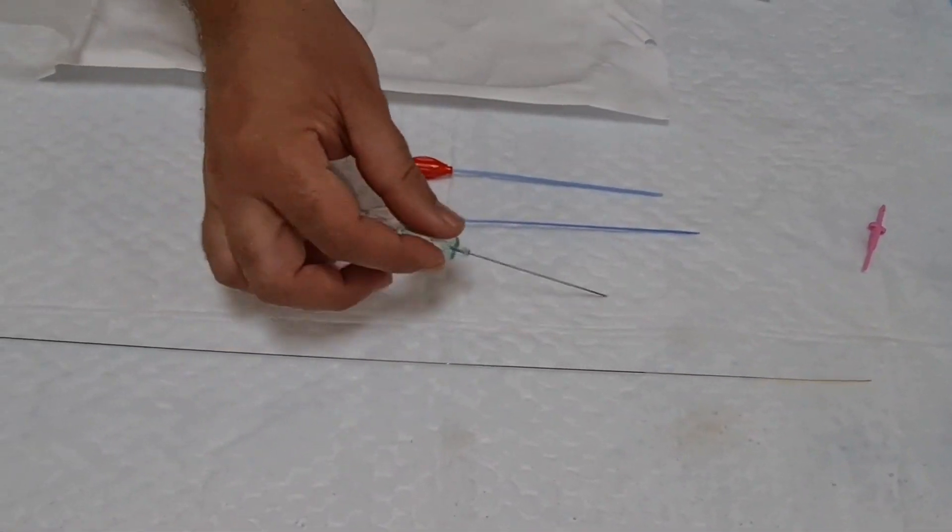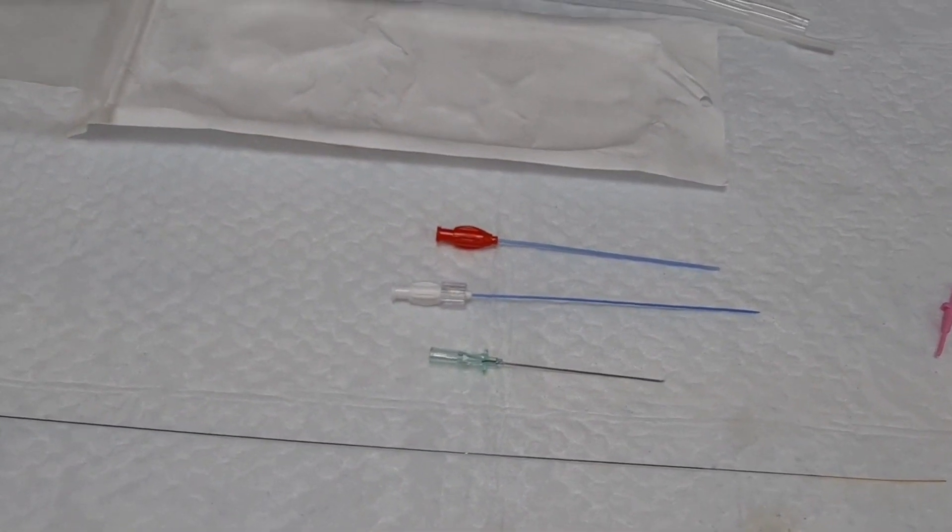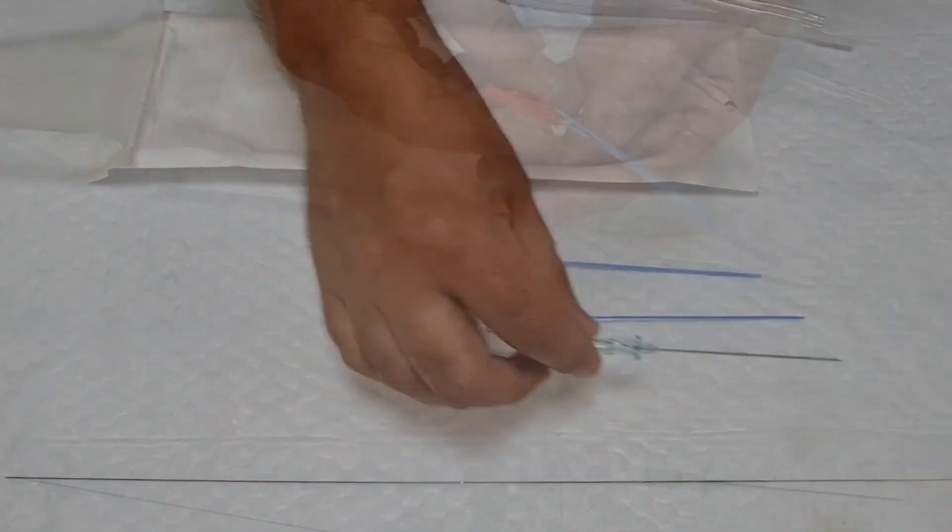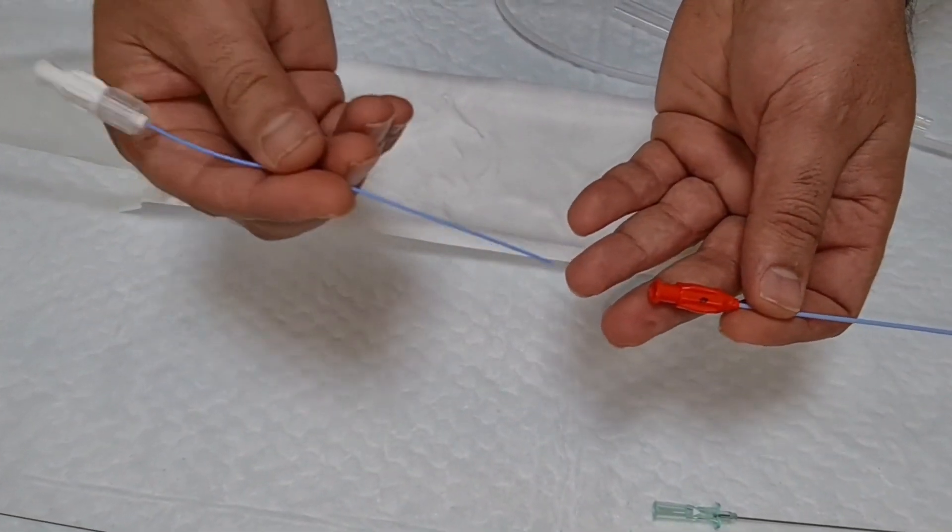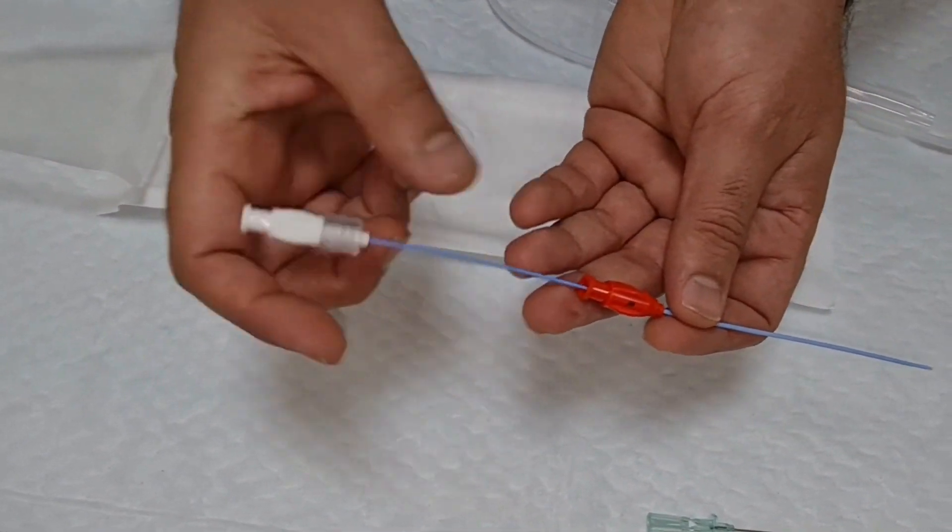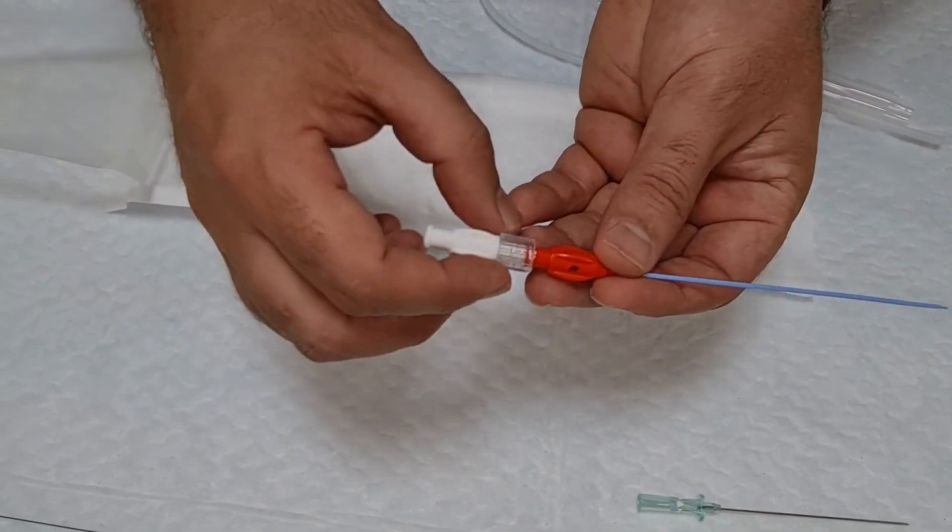Now the question is how we use it, how to prepare it for the use. So insert the dilator into the sheet, rotate it to lock.